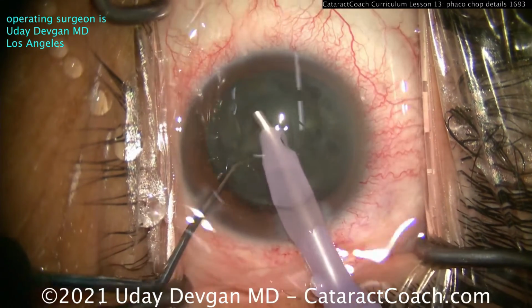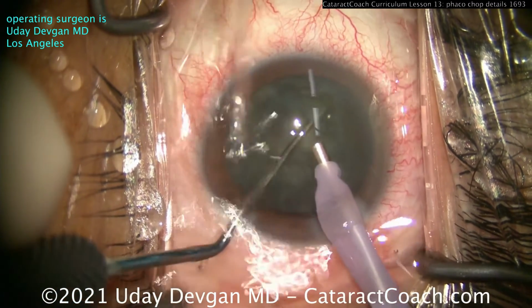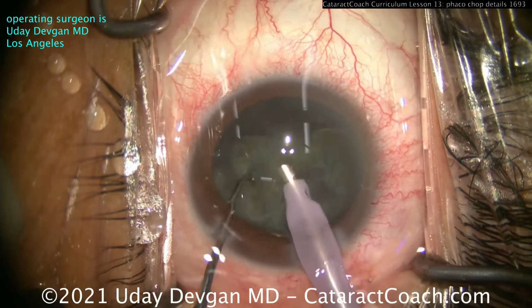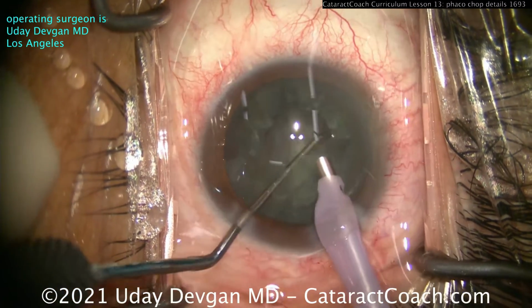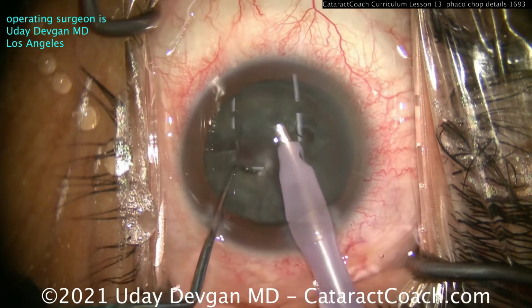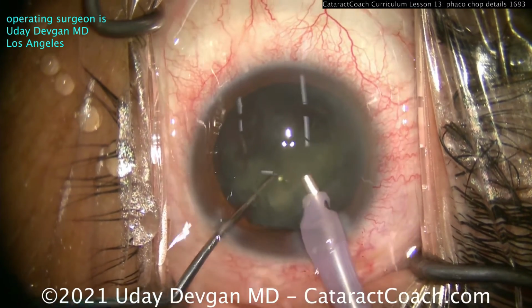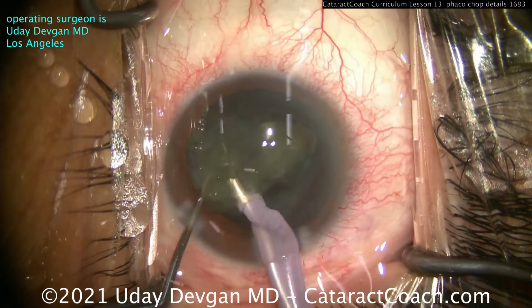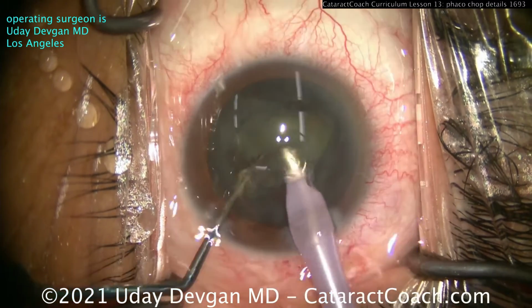So we're using the vacuum to draw the cataract nucleus away from the capsule and keep it central. And as best as we can, we want to bring this lens material, this nucleus, out of the capsular bag, away from the posterior capsule. That's our safe zone. Be very cautious. If you give Phaco energy right now, it'll go right through that nucleus and right through the capsule. You heard that click sound. That's the sound of sadness.